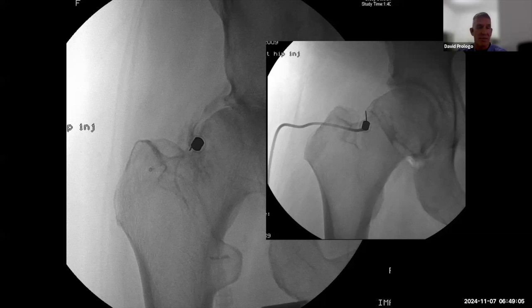I'm going to wrap this up pretty soon, but I want to leave you all curious for more. This is an old image, right? This is what we did. This is what we had in our toolbox for hip pain, which was an intra-articular injection. And we would be so proud to see this band of contrast, and you would know you were intra-articular, and lateral here to stay away from the femoral vessels. And for years, that was what we had.